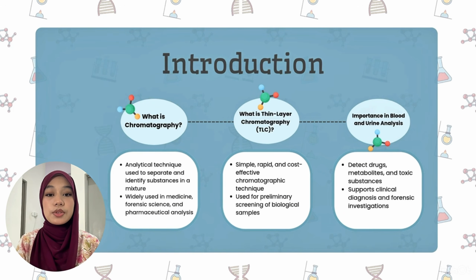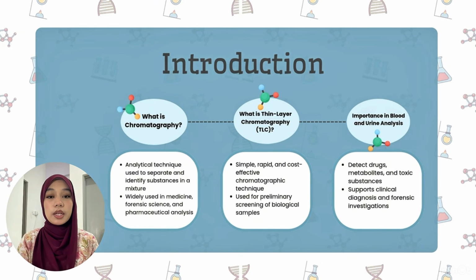It is widely used in medicine, forensic science, and pharmaceutical analysis, because it helps detect substances present in complex biological samples. In this experiment, we use thin layer chromatography or TLC, which is a simple, rapid, and cost-effective type of chromatography commonly used for preliminary screening.